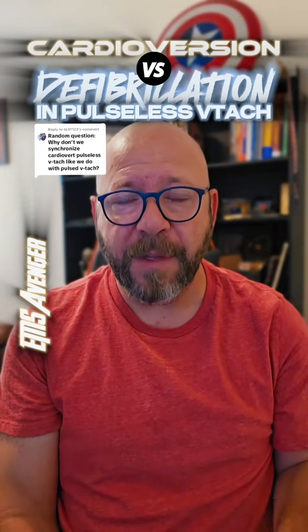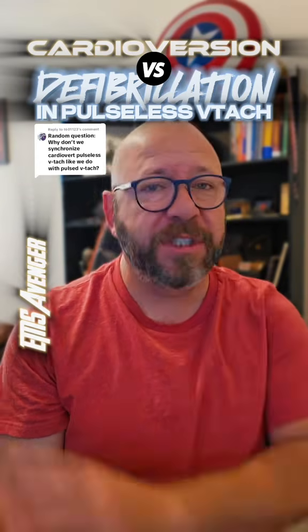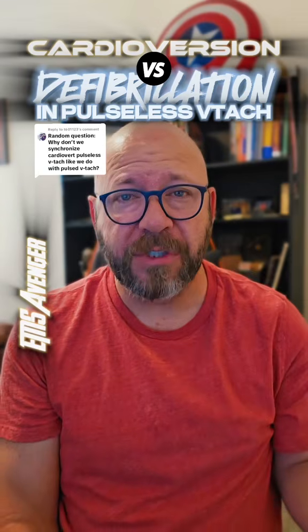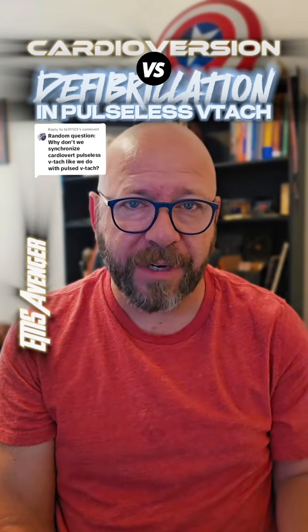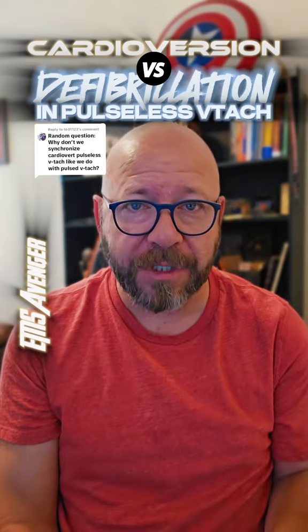waste time. If the patient is in VTAC and we recognize VTAC when we do our pause during our compression cycles, we just defibrillate and that's it. And the reason why we do this is to just make it a simpler, easier process. Traditionally, the limb leads had to be applied to the patient in order to synchronize. Synchronization can take a couple of seconds that patient doesn't necessarily have during that peri-shock pause.